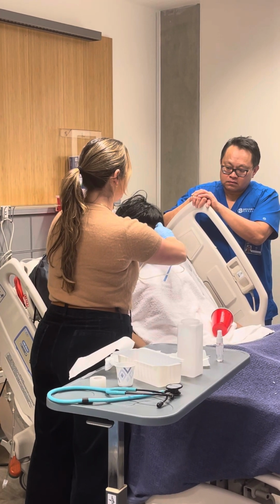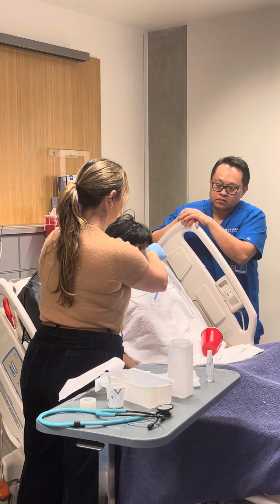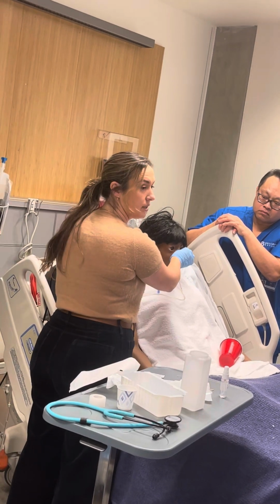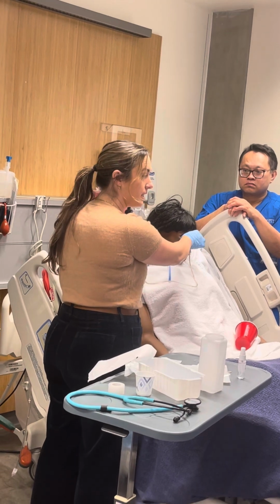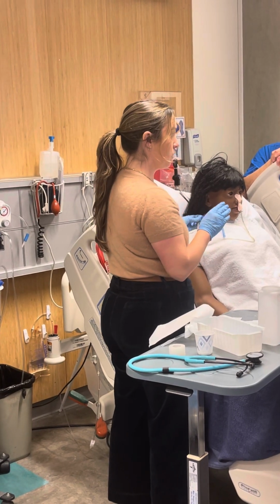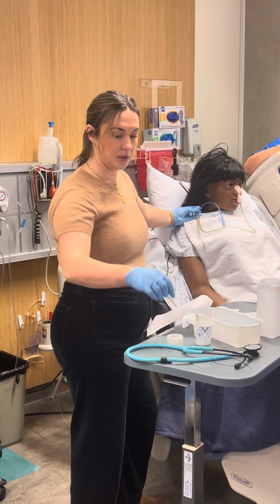Because this mannequin's made of silicone, it doesn't stick great, but it sticks on those mannequins better because they're made of plastic. And then you're just gonna push it here. I personally never do a super great, foolproof securement on the nose until I know I'm in the right spot. After my chest x-ray is confirmed, I'll come in and really make sure that my securement is great. In your video, I think it says tape it, and then it says secure it once confirmed, so just verify that in your ATI sheet.